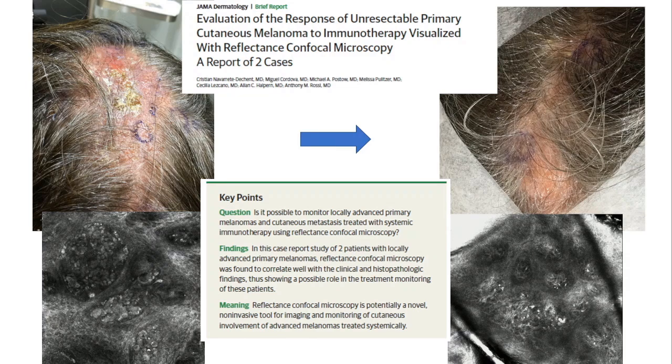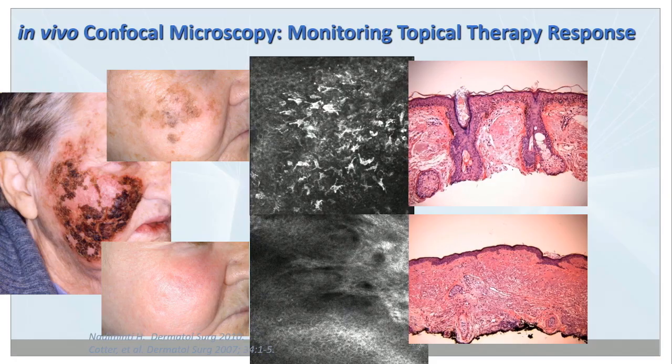And then after immunotherapy, not only do you see clinical resolution in the scalp, and you can even see hair growth, but under real-time imaging in the bottom right, you can see the tumor islands look different, right? They have different morphology. They're smaller. The cells are more shrunken. They almost look pycnotic, as you would see under histology, and they look necrosed. So the tumor has basically died.